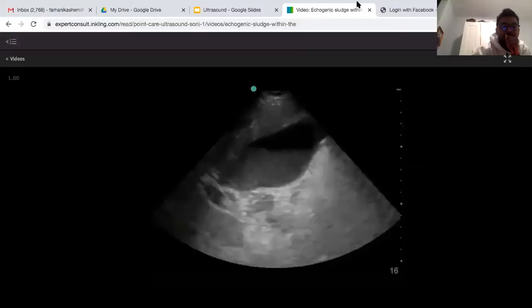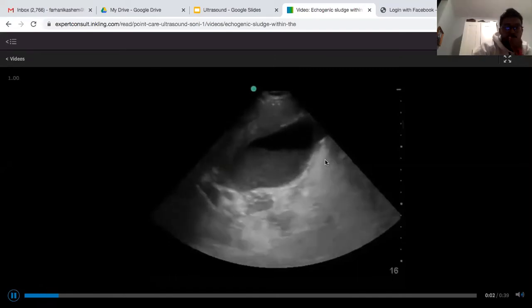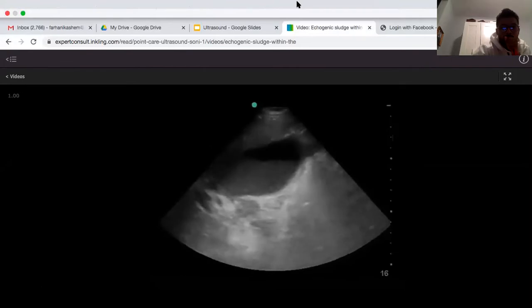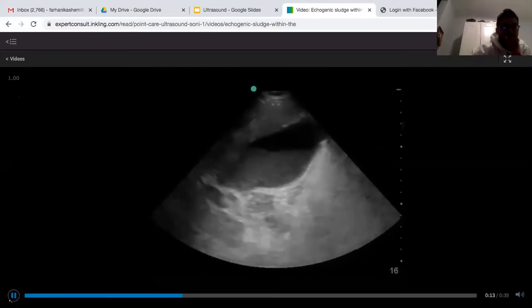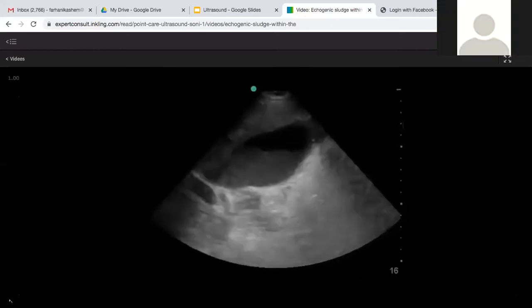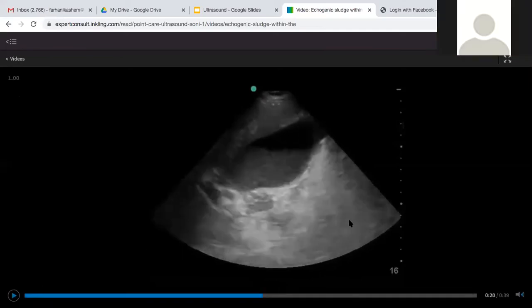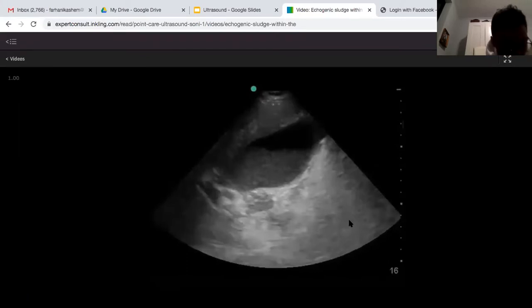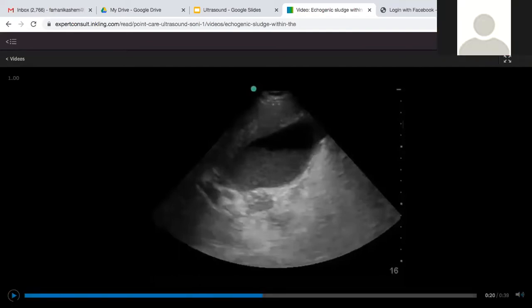All right. So in this one, which way is the fundus, Kenny? Tell me which plane I'm in. Do you see the gallbladder in profile? It's long and in profile, right? I think I see the exclamation point you're talking about. So what plane is this? Longitudinal plane. Imagine along the longer length, and we see the longer length of the gallbladder. Longitudinal, right? And you see the exclamation point, right?